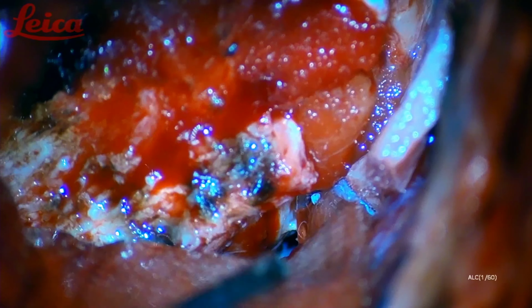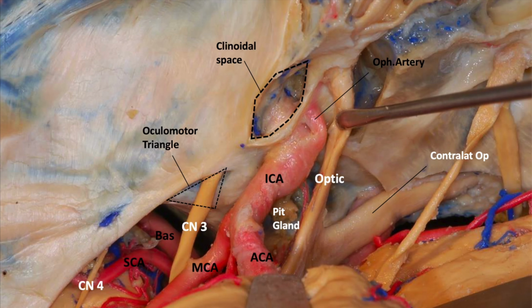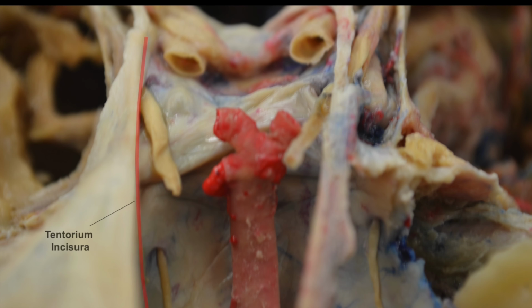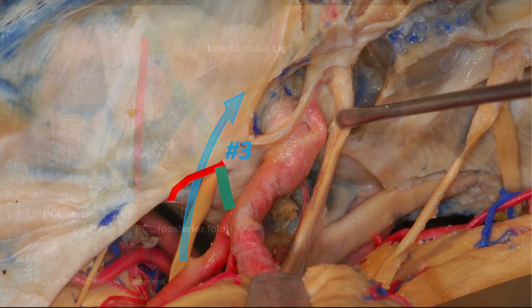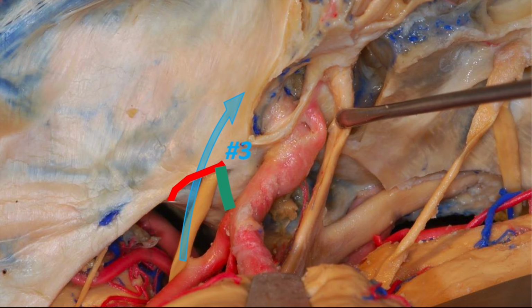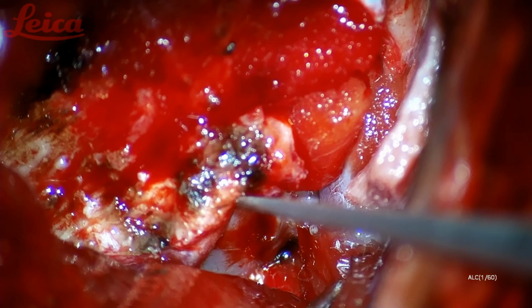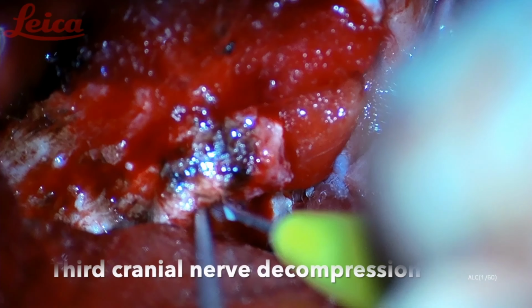At the end, the key of this intervention is to resolve the third cranial nerve compression at the oculomotor triangle. This triangle is composed of a thickening of the anterior tentorial edge, which is called the anterior fold of the petroclinoid ligament, the posterior fold of the petroclinoid ligament, and the interclinoid ligament. The third cut communicating the intradural and extradural space is done over this triangle to free the third cranial nerve at its entrance into the superior compartment of the cavernous sinus.